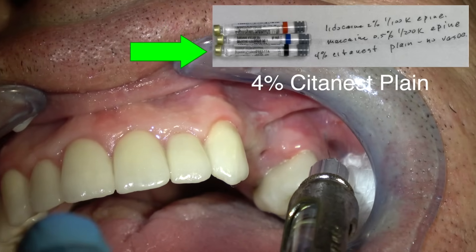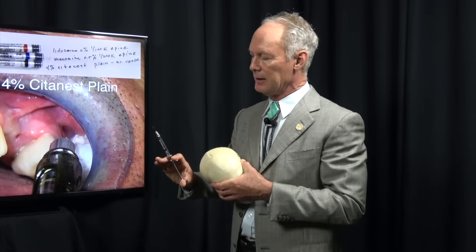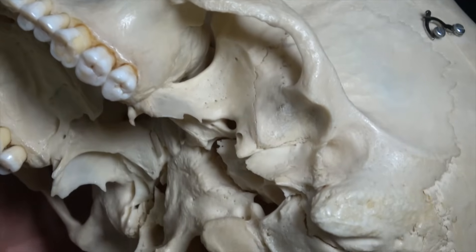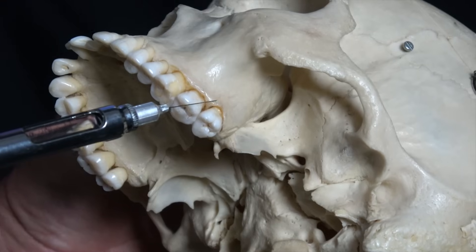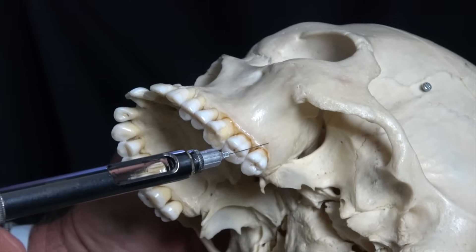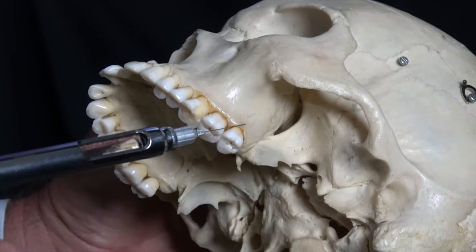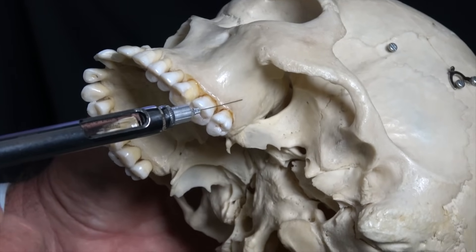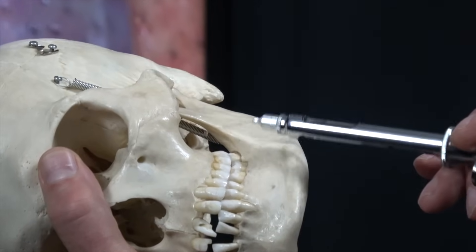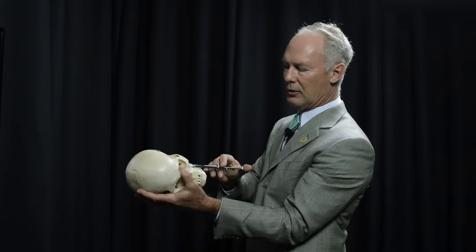I'm using a 30-gauge short needle, turning the bevel toward the bone. I put a tiny bend in the needle just so I know which side the bevel is on. Right at the coronal part of the unattached gingiva — don't give the injection in attached gingiva, give it in unattached — I'm going to barely go under the tissue and just tap the end of the syringe to express some of the Citanest plain. Then go a little bit further, tap again, a little further, tap again, but keep it against the bone, against the alveolar process. Keep it right on the bone and slide it all the way to the end of the needle.